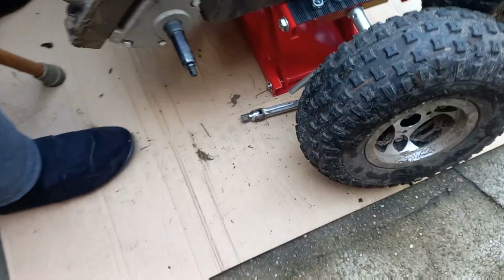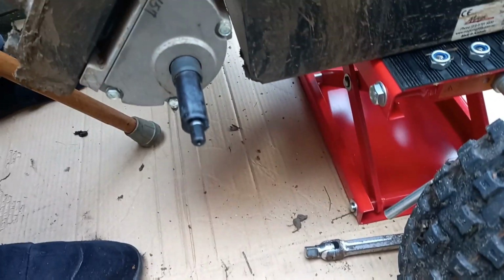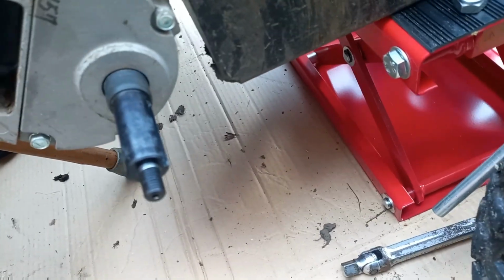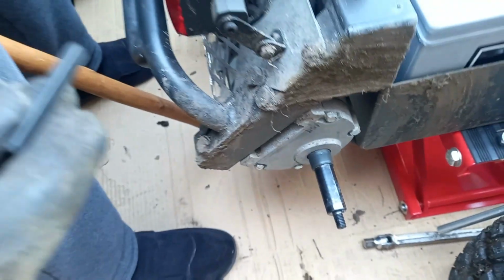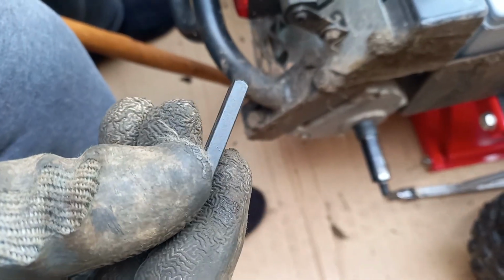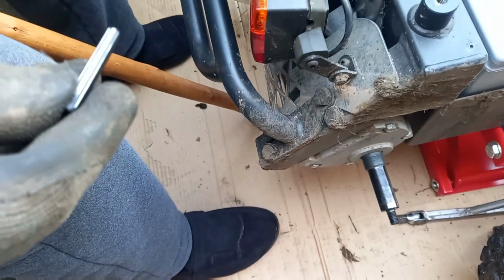Yeah. We've got the wheel off. John thought it was splines, but it's not. It's actually a woodruff key, which is a little bit worn. If you look at that, there's some fretting, and there's a bit of a step in it on both sides where it's been moving, and a bit of a silly idea, really.